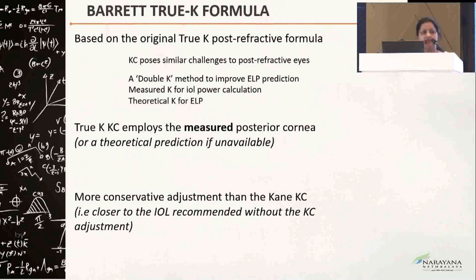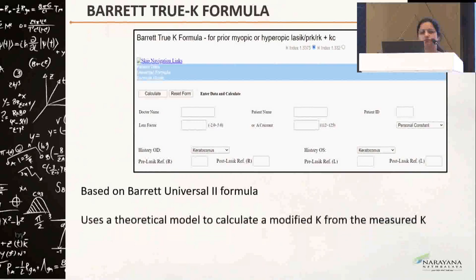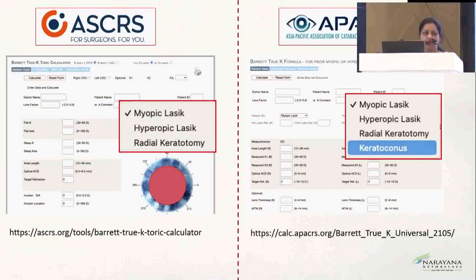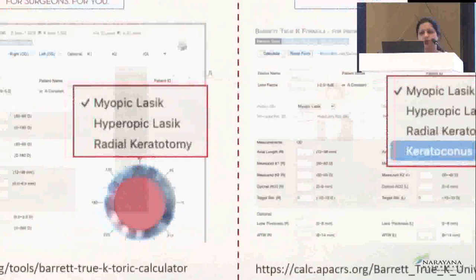In case we have biometry which does not give us a posterior cornea, we can use the theoretical prediction and enter only the anterior K values. It is more conservative than Kane KC because it is closer to IOL recommendations which are given without KC adjustment. The mathematical formula for this calculation is not yet published. If you go to the ASCRS website and try, keratoconus does not appear in the drop-down menu. We need to go to the APACRS website to find the drop-down menu.